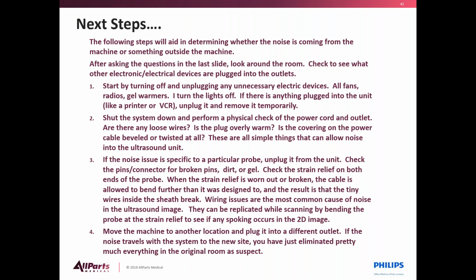Shut the system down and perform a physical check of the power cord and outlet. Are there any loose wires? Is the plug overly warm? Is the covering on the power cable beveled or twisted at all? These are all simple things that can allow noise into the ultrasound unit.